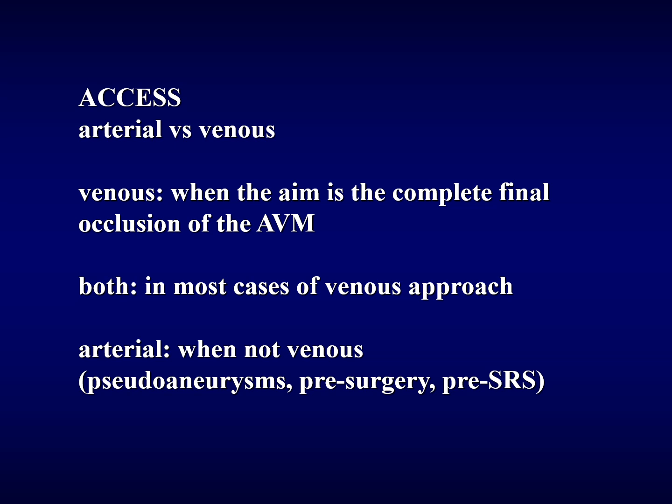in cases, as you have seen, of pre-surgical or pre-radiosurgical embolization.